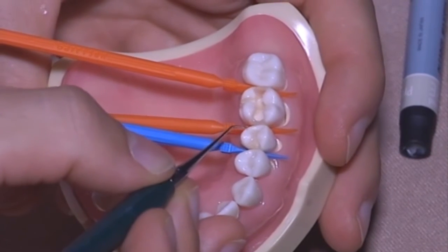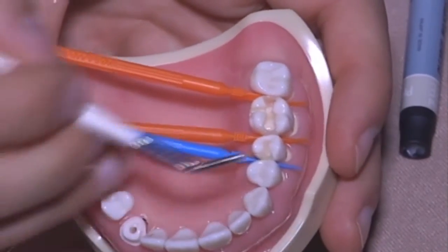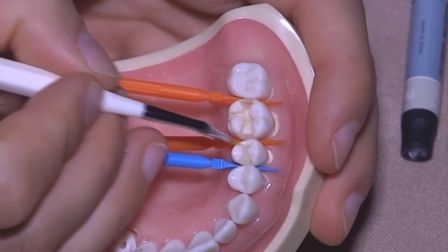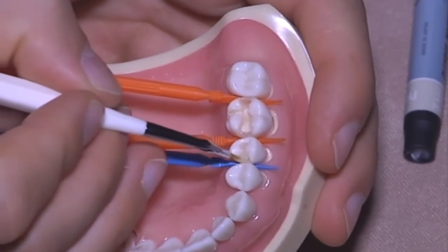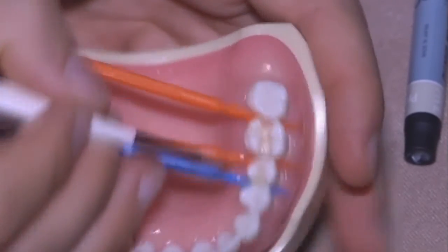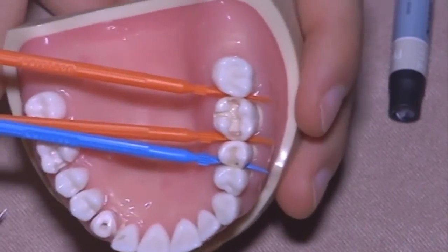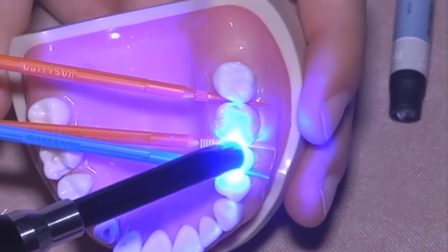Just 2 little circles there because of the premolar shape, and then I also work with little brushes in order to have a better adaptation on the margin with more gentle instruments. Once you check that the direction and the inclination is correct, light cure.